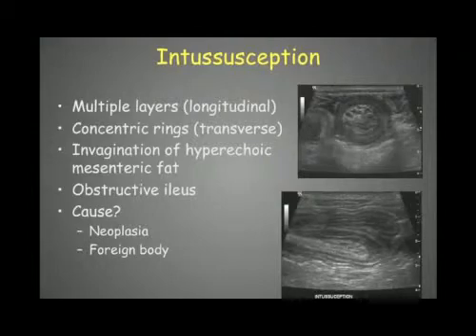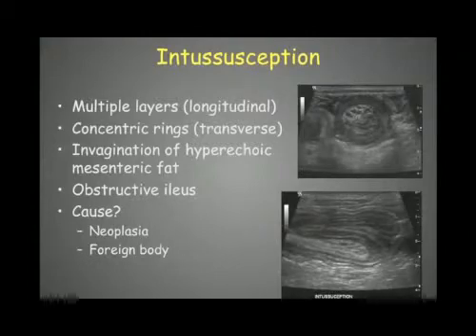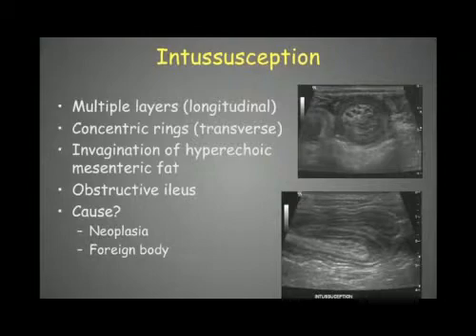We can also see hypoechoic areas corresponding to mesenteric vessels. We can apply a colored Doppler examination to see if flow is still present within those mesenteric vessels. If flow is still present, it means the flow can still pass, which is a better prognosis for surgery — meaning the intussusception may be reducible and a complete enterectomy may not be necessary.